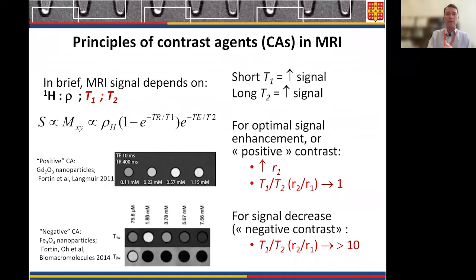So 1 Tesla. The contrast effects would be somewhat different if the test was performed at 7 Tesla or 9 Tesla. The main preclinical MRI systems used for neurological studies in rat brain, for instance, are mainly performed at 7 or 9 Tesla.